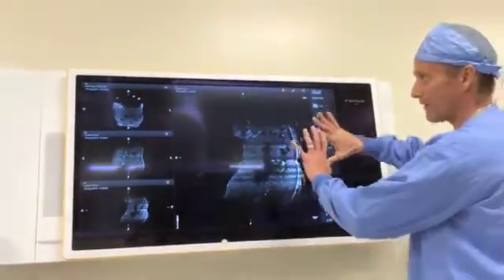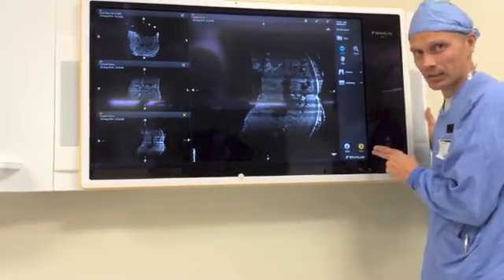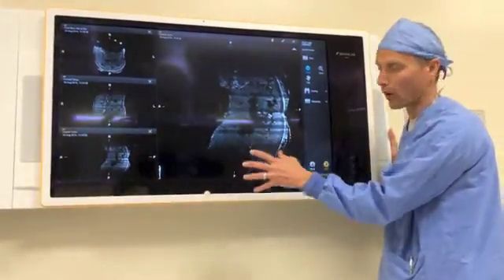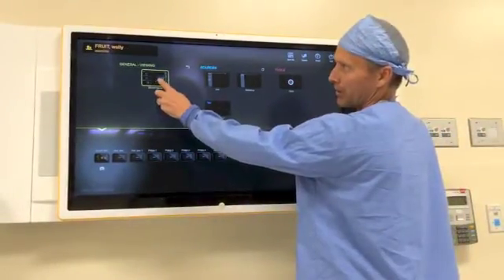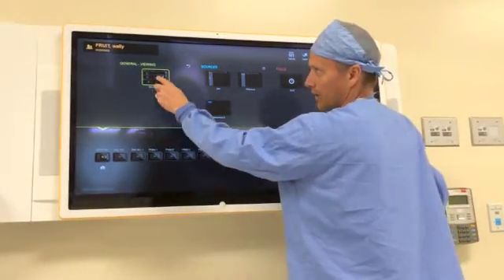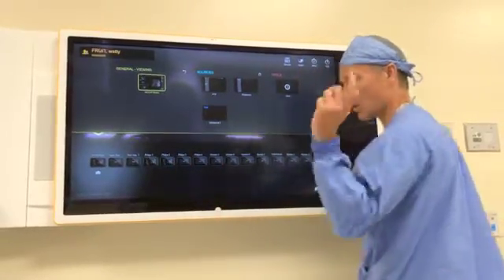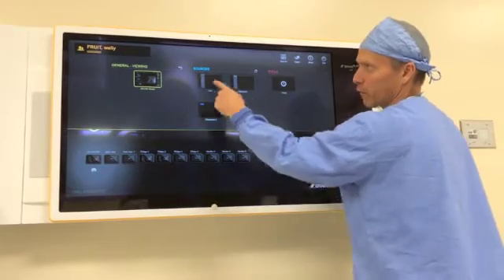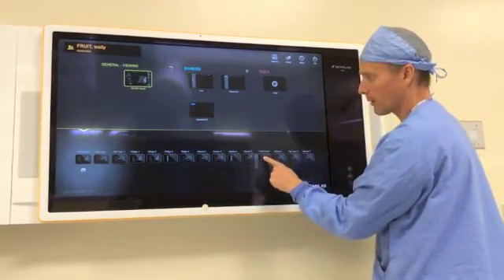The next step in the workflow: once we have the images up and we want to route around the room, we're going to go to our home button. Your tendency will probably want to hit Done — don't hit Done here, because that would be like closing the app, saying you don't want to use the DICOM viewer anymore. Press the home button instead, and you can see now I'm back to that startup screen where I have my patient images queued up. Now it just becomes a destination game — if I want this on one of the monitors listed below, I'll just grab it and drag it to where I want it.